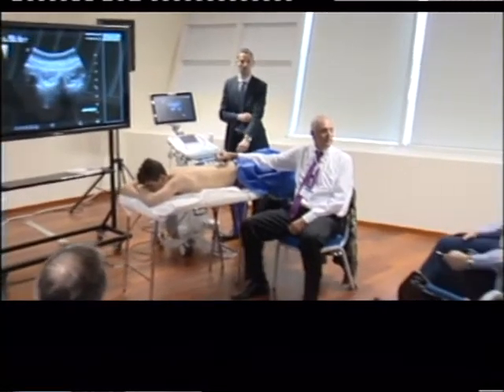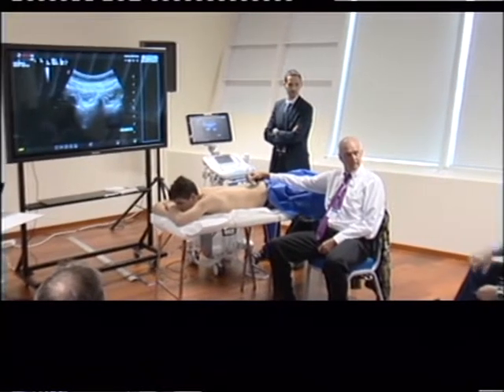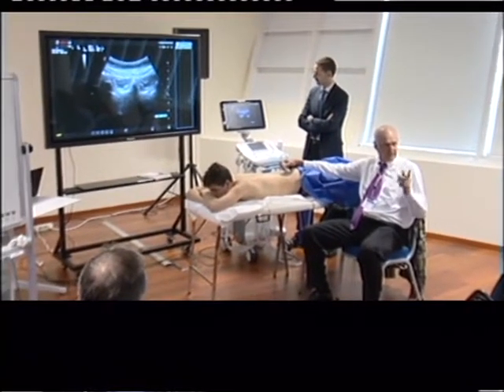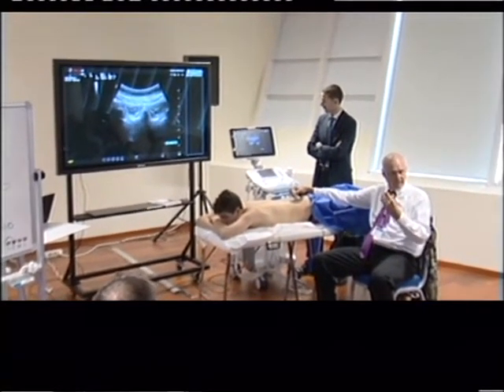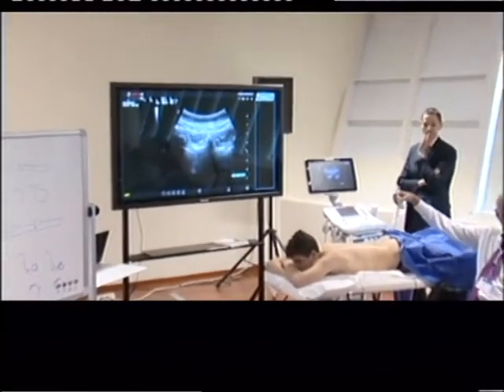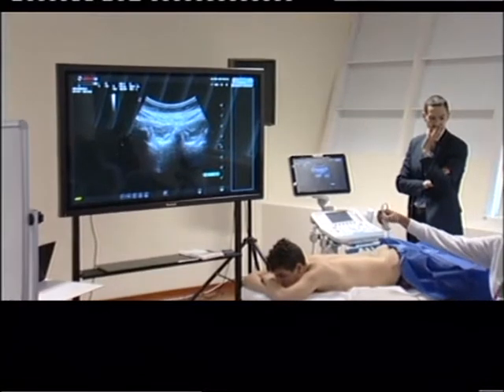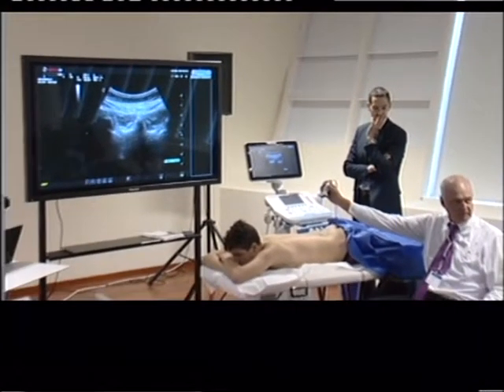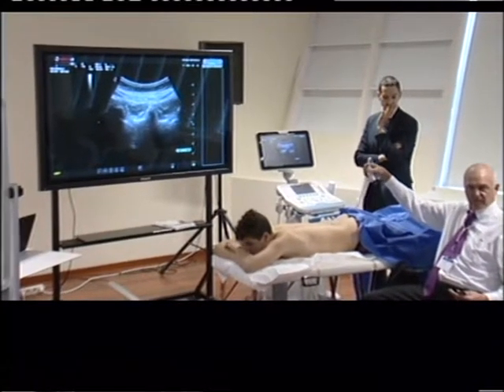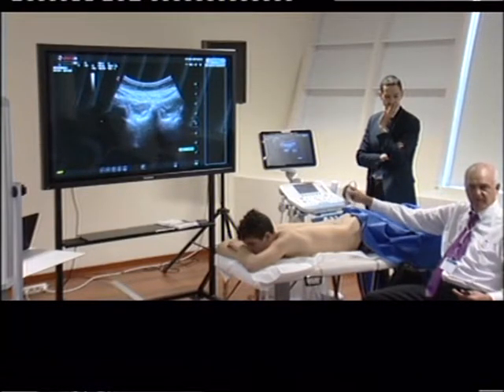Okay, so if you look at the probe, se guardiamo la sonda, the important thing is, to do the first sacral foramen, you have to be at 35-40 degrees. Per vedere il forame, il primo forame sacrale, dobbiamo stare inclinati a 30-40 gradi. So when you're doing L5, L4, L3, L2, L1, cioè la inclinazione cambia. And then you go sacrum, hiatus. Hiatus, sacrum, 5, 4, 3, 2, 1.